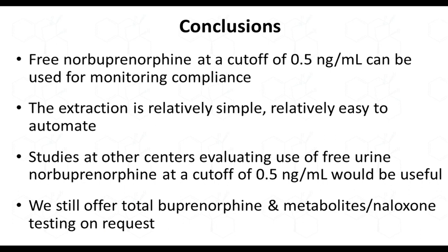Now, Dr. Stone, do you have any problems with matrix effect in the samples encountered with routine production testing? Yeah, so as I mentioned, unfortunately, we do see some severe depression of the internal standard, therefore reflecting also depression of the analyte signal for free norbuprenorphine. We don't see that with naloxone or with buprenorphine.